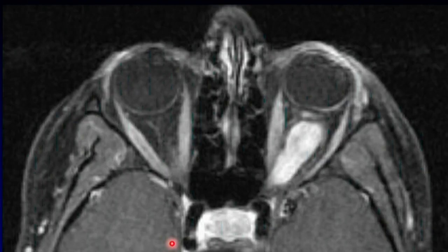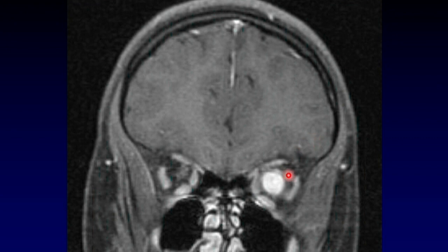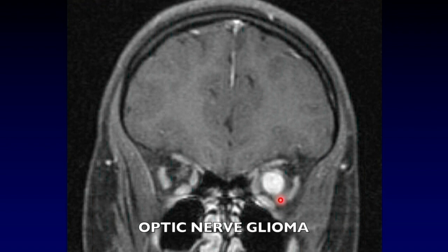Here's a lesion that is running right along the expected course of the optic nerve. When we see it in coronal image, it is uniformly enhancing and it is a mass of the nerve itself. There is no preserved central nerve — this is the nerve expanding and enlarging. This is what an optic nerve glioma looks like.